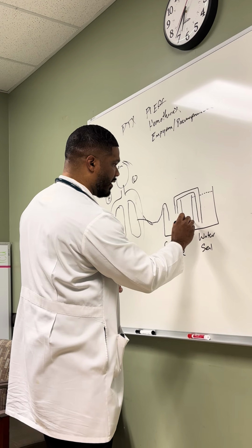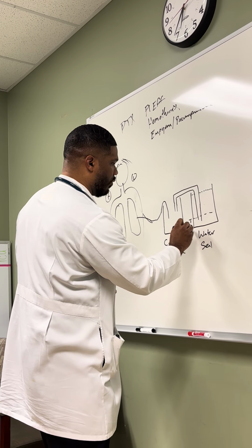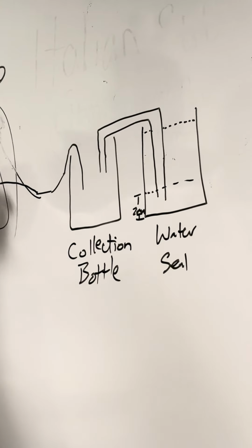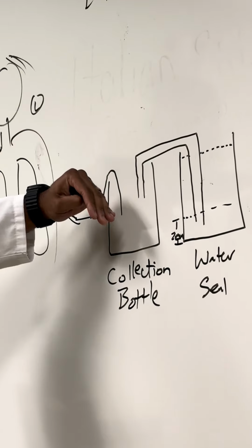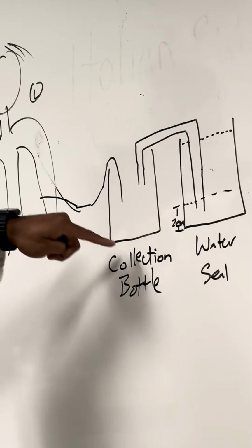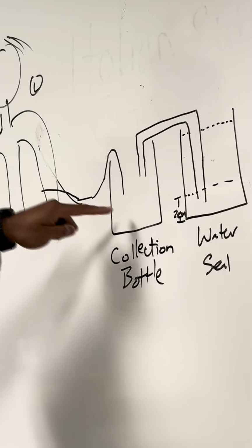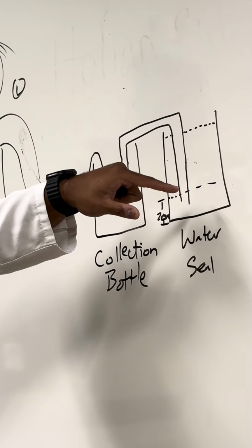We would take some water, about 2 centimeters high of water, and we would take a tube and put it down there, because now when the patient takes a breath, air is able to leave the pleural space through the chest tube and get drained into the collection bottle. But when the patient takes a breath in, with negative inspiratory force on the chest tube, we're not able to get any air back in because it is now sealed off by water to the environment, right?